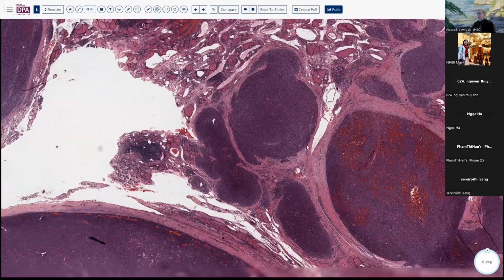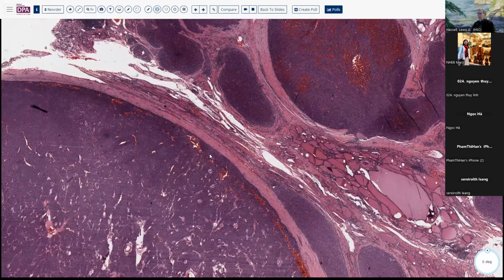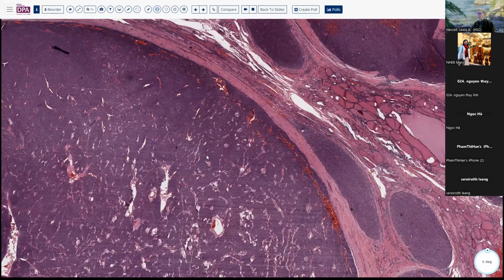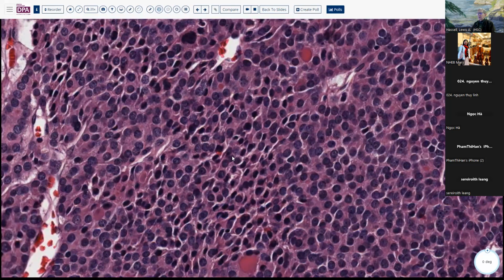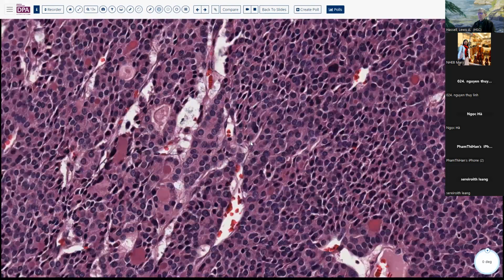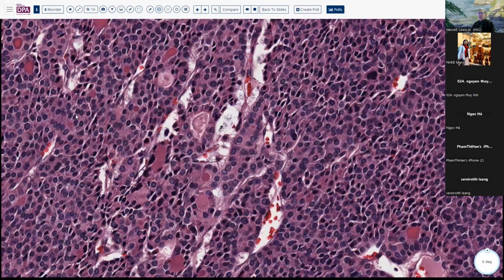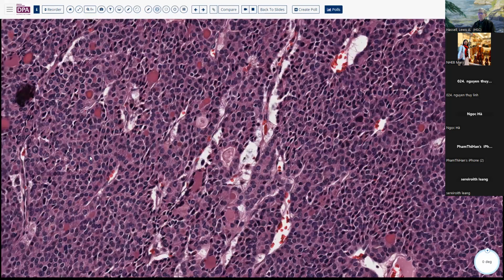And it can look relatively bland on cytology, as we've indicated. Just take one more look at these nuclei. And I think you can see this might be thought of as a neuroendocrine tumor or something like that. If you didn't know where it had come from, I could persuade you that this was maybe from the pancreas or from a GI site, with this sort of insular pattern of growth, a few pseudoglandular foci and so forth.